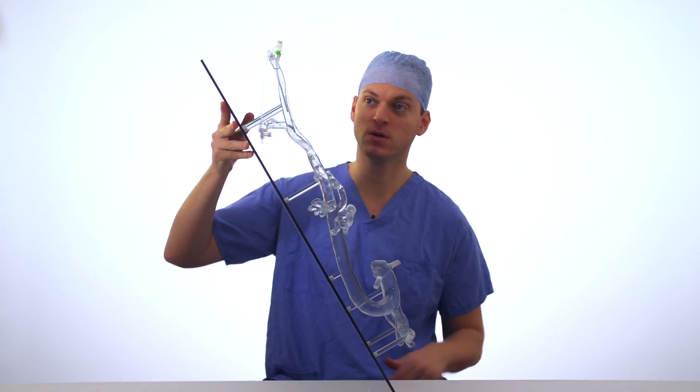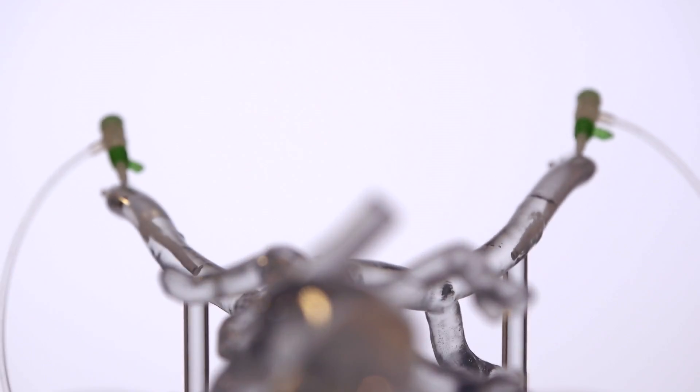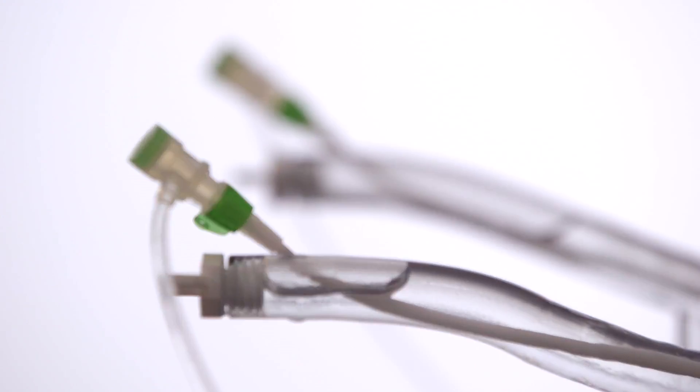Using Arteriosim is very easy. Simply turn the model up like this, fill it with water from those sides there, put two 6 French sheaths in, and you're good to go.